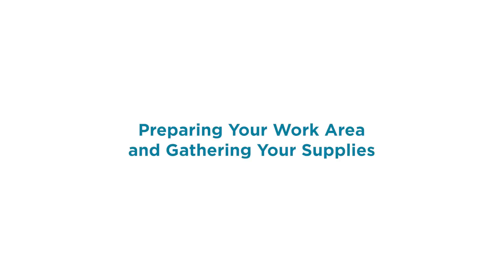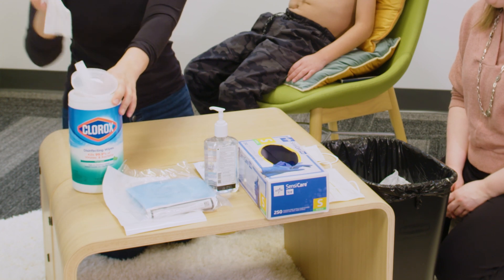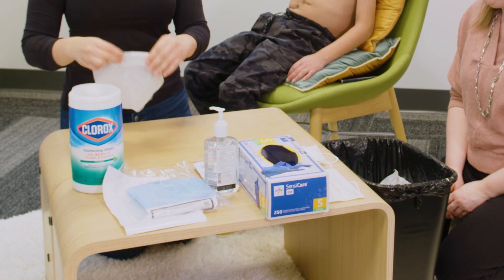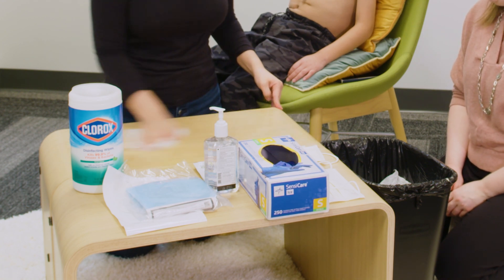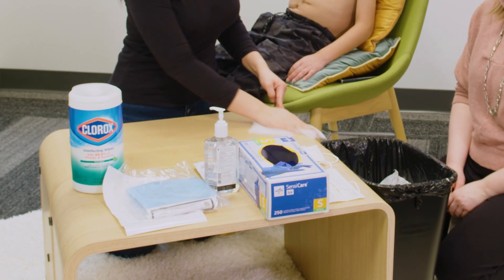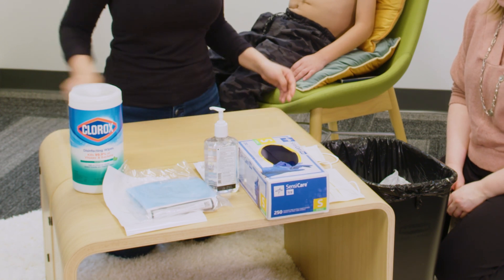Preparing your work area and gathering your supplies. Start by cleaning your work surface by wiping vigorously with a disinfecting wipe. Be sure to keep other small children and pets away. Remove or push any clothing that may come in contact with the central line during the dressing change. It is best to have a large area to work with.